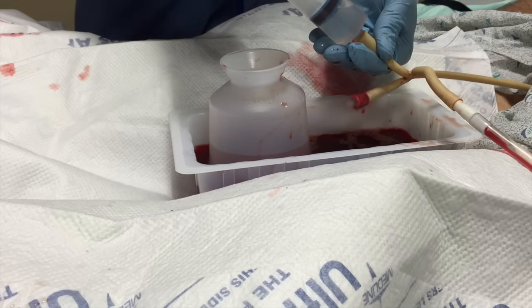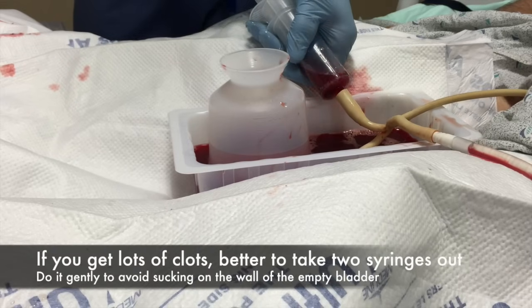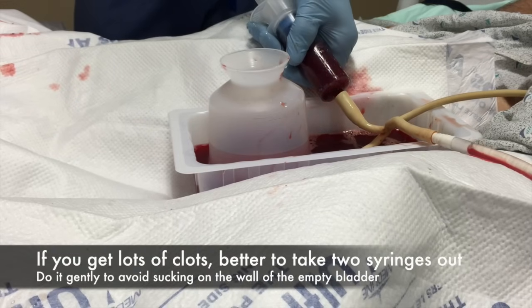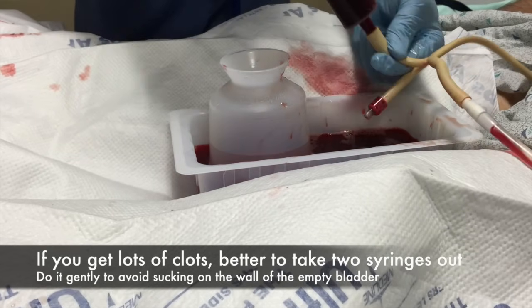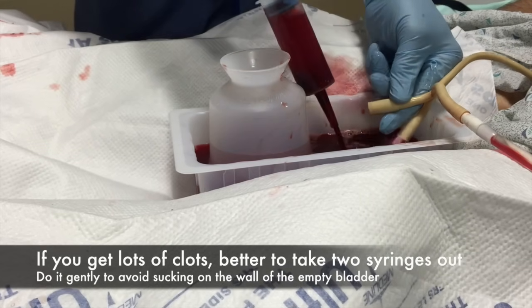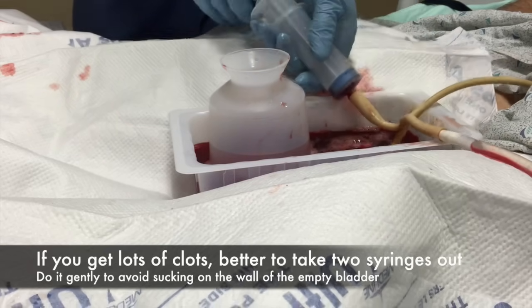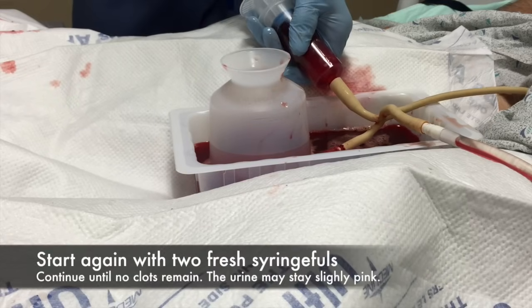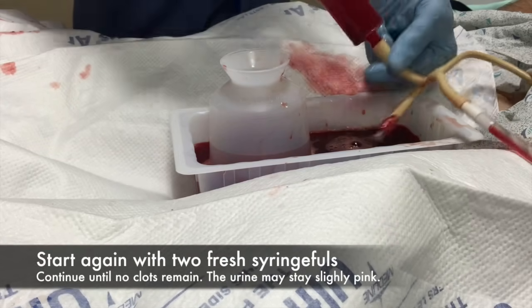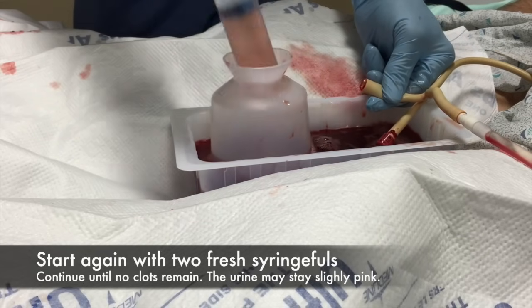Another word of advice is to watch this video several times before trying this. If you're going to try to suction out two syringe fulls after you've only put two in, you just want to be careful and gentle with the second one. If there's any resistance or the patient is uncomfortable, just fill them up with another clean syringe full before you start pulling back again.